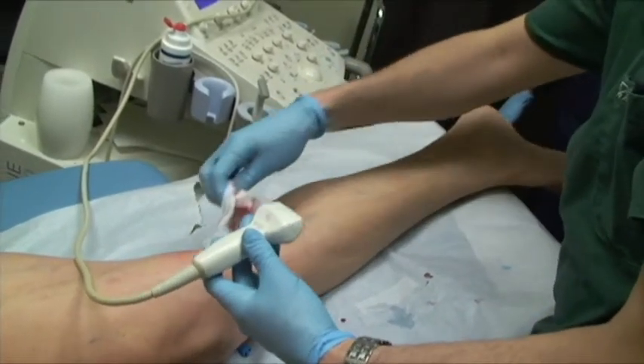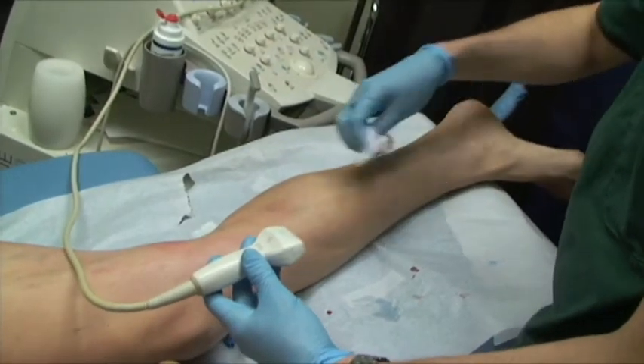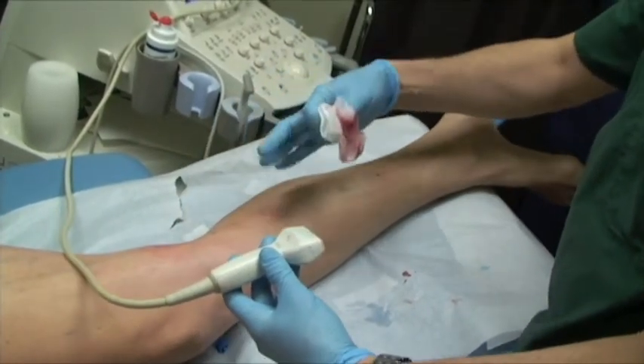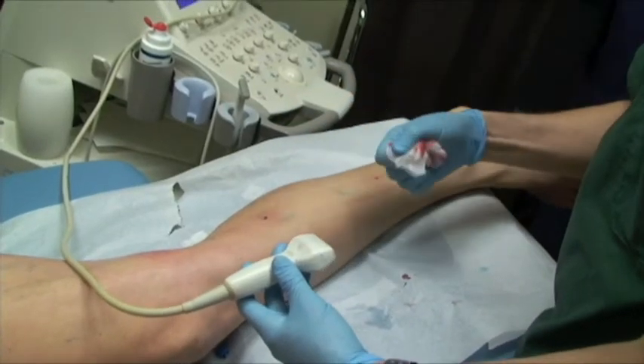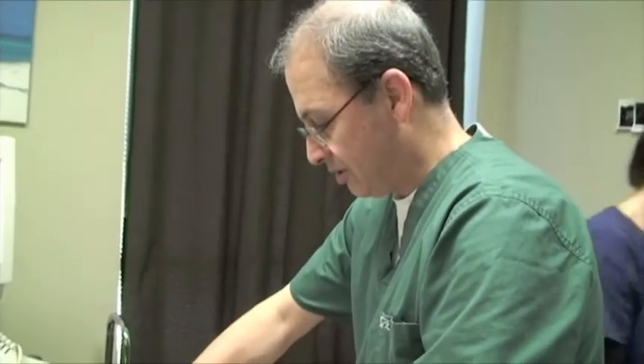Do you feel any pain right now? No. Because usually with regular treatment, patients feel a rather severe pain initially from the vein spasm. But with this technique, interestingly, nobody has complained of pain after treatment.